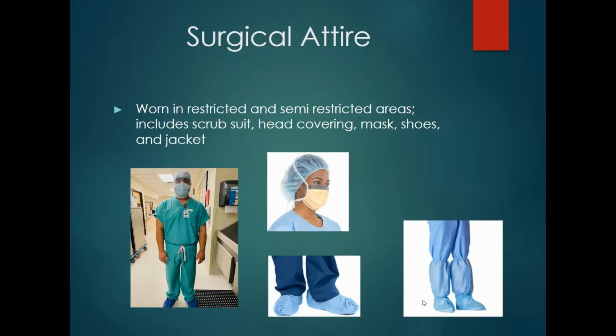And if you're doing any cases where you anticipate a lot of blood loss or fluid loss, then I would recommend you wear these long, larger shoe covers. Examples of these cases would be C-section. Even though the drape is supposed to contain the amniotic fluid when we perform the C-section, sometimes that drape doesn't catch it. So all that fluid, you don't want it on your shoes, or your scrub top, your scrub legs. So I would recommend wearing those. Orthopedic cases, we also wear those. There's a lot of irrigation loss during the arthroscopies, and the floor is really wet, so you don't want it to soak through.